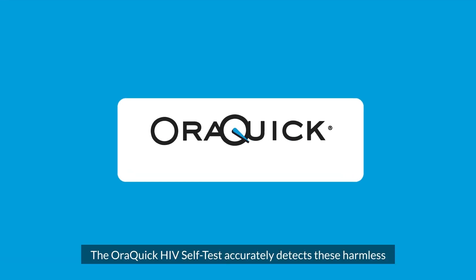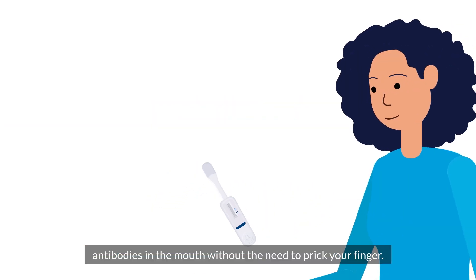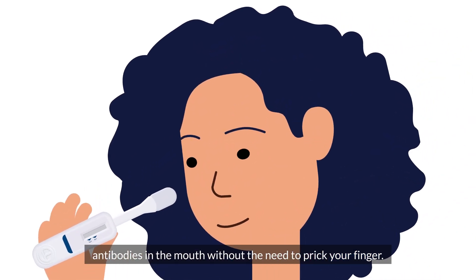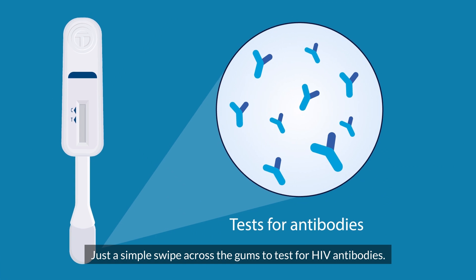The OraQuick HIV self test accurately detects these harmless antibodies in the mouth, without the need to prick your finger. Just a simple swipe across the gums to test for HIV antibodies.